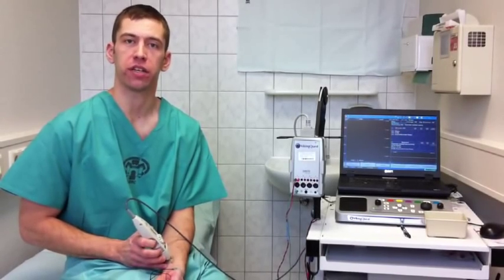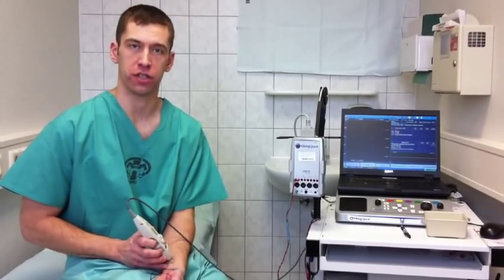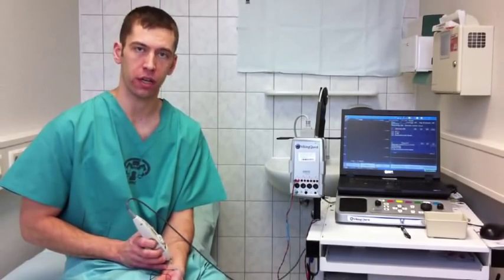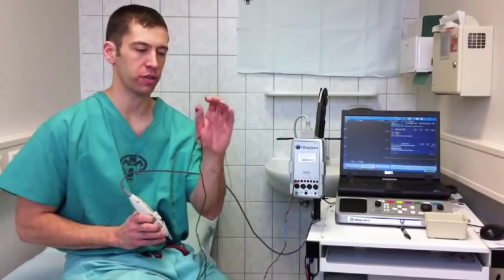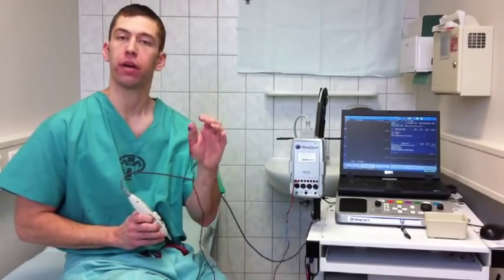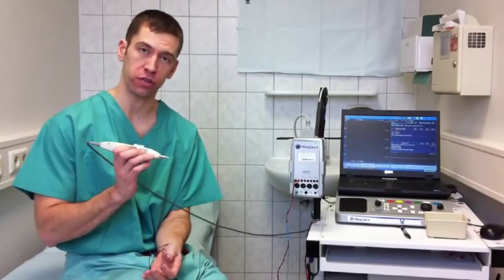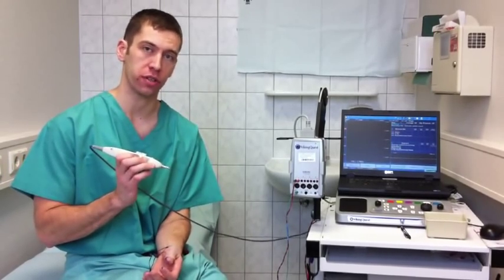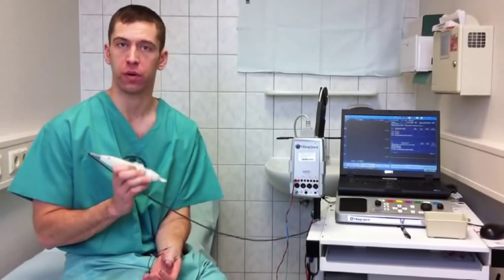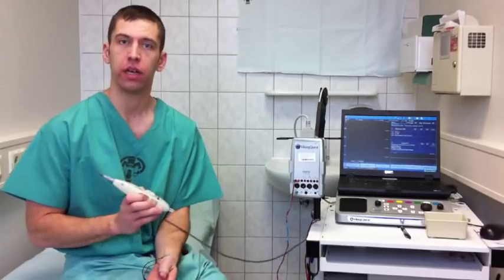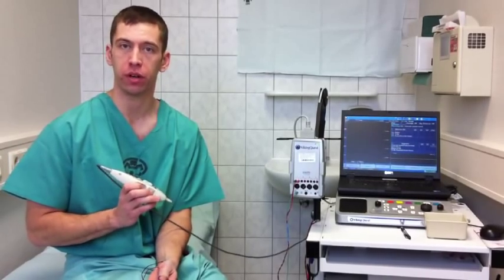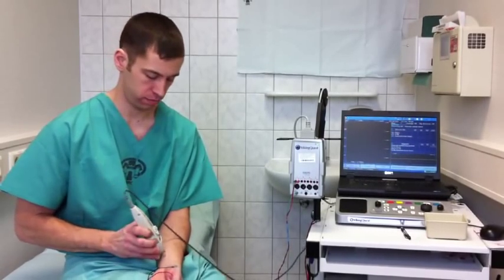The first part of the EMG test is the nerve conduction study. During this portion of the study, small electrodes are hooked up to your arm or your leg and a stimulator is used to deliver small amounts of electricity to the nerves that we're testing. Typically, we will test two or three nerves in your arm or your leg.